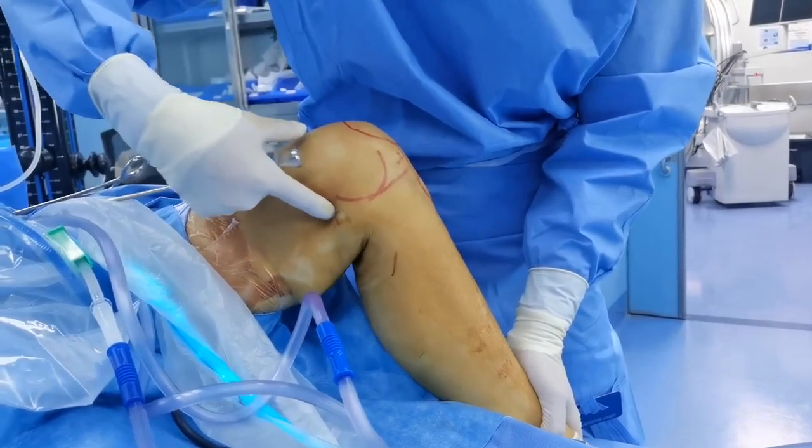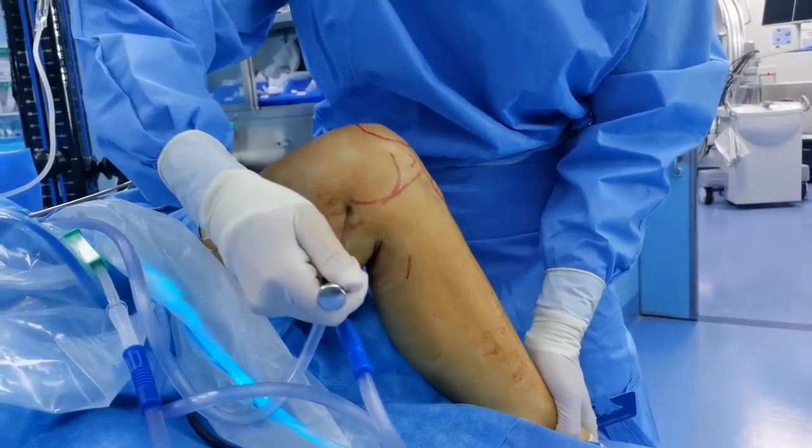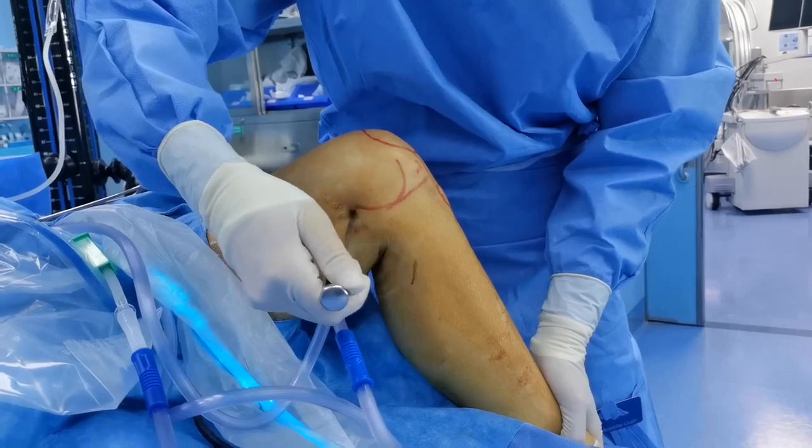When the foot stands on the stool, the soft tissues on the posterior aspect of the knee joint resemble a relaxed and natural situation.